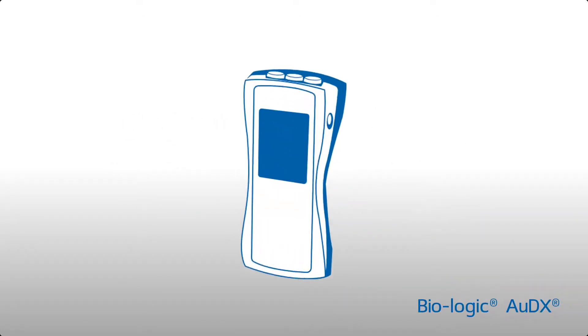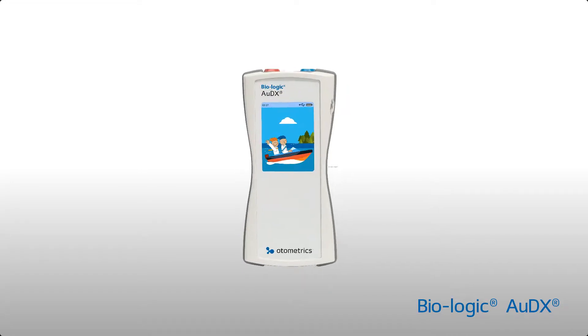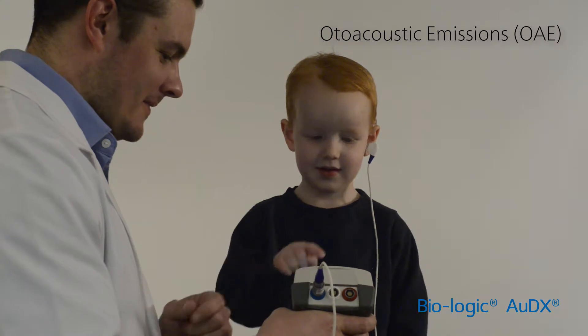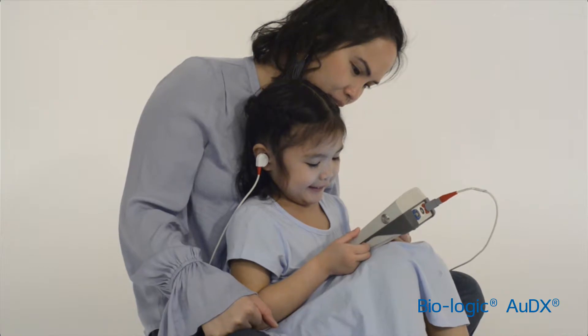The Next Generation Biologic Audix is a fast, easy to use, and efficient hearing screener from Otometrix. Audix is configurable for otoacoustic emissions and pure tone audiometry, appropriate for screening patients of all ages.